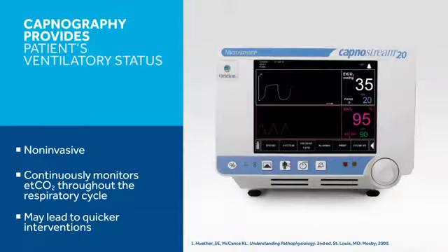If you were to measure your own pulse oximetry and capnography while holding your breath, you would notice that the CO2 waveform will immediately alert you that there is an absence of CO2. However, because there is still oxygen in the blood, pulse oximetry will continue to show normal oxygen saturation values for some time.